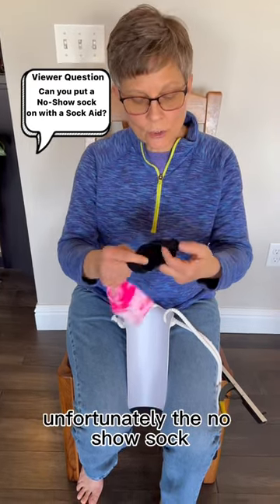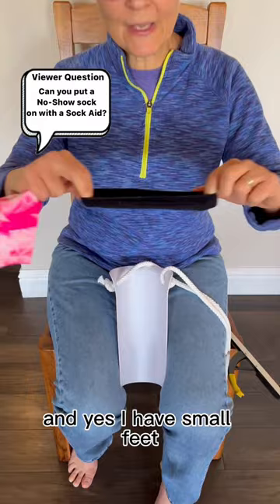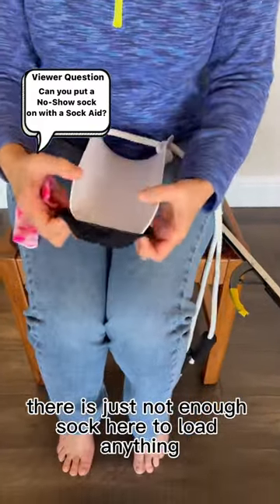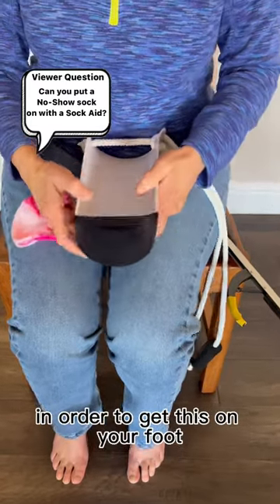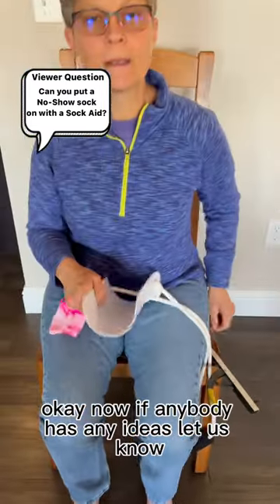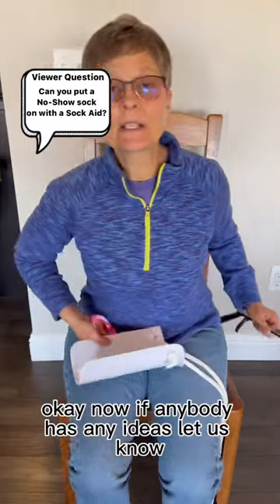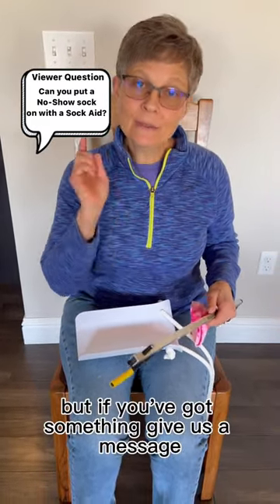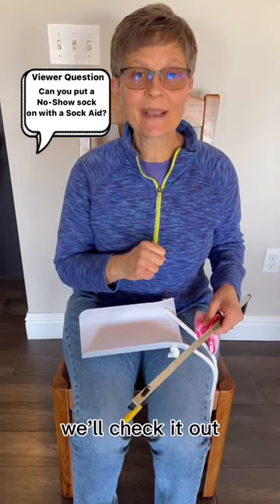Unfortunately, the no-show sock — and yes, I have small feet — the no-show sock is too small. There is just not enough sock here to load anything in order to get this on your foot. If anybody has any ideas, let us know. Maybe start with a reacher, but if you've got something, give us a message. We'll check it out.